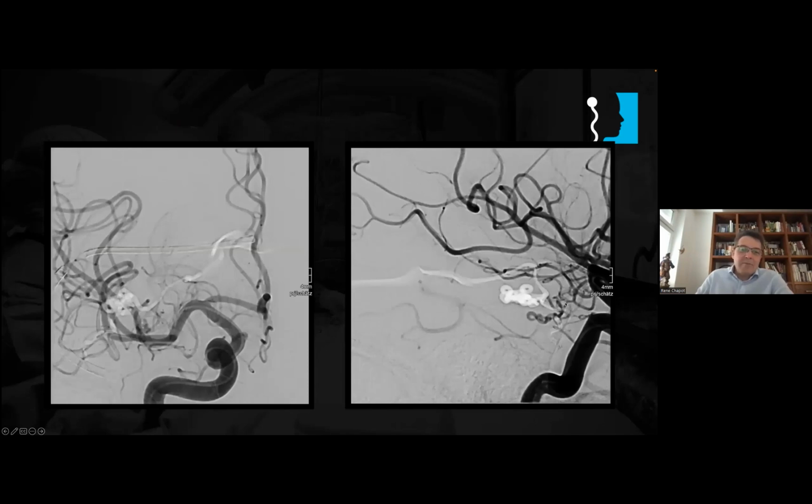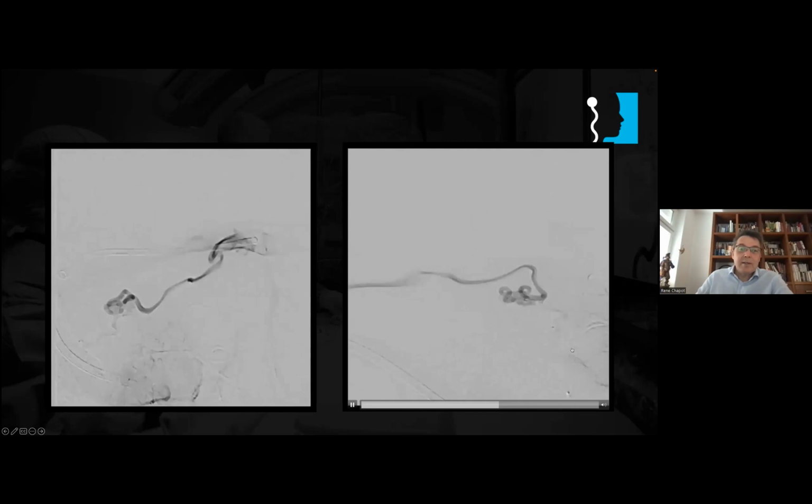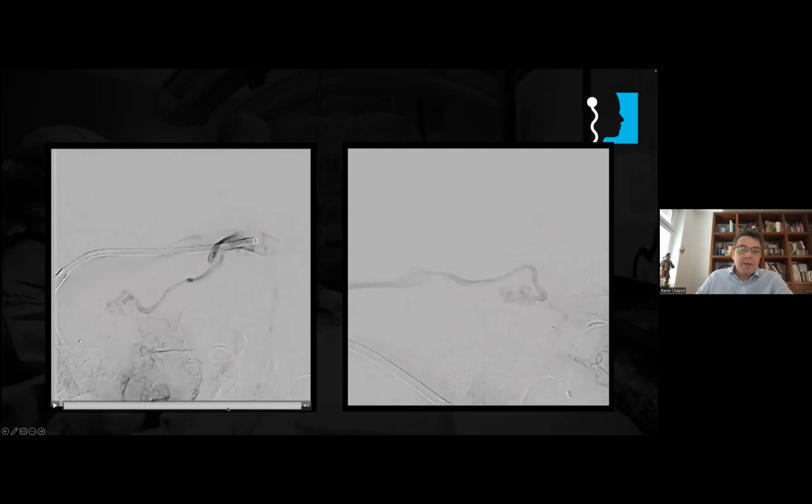So we take a second microcatheter and we search for it. And at some point, we find the second feeder, which is here. This is feeder number 2. So here on this picture, maybe the movies are not coming so well, but here I think that this picture is quite well. You see one feeder, the main one, and you see the second one giving this other part of shunts.